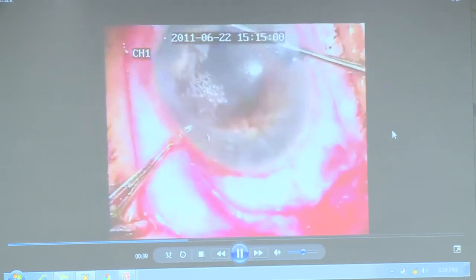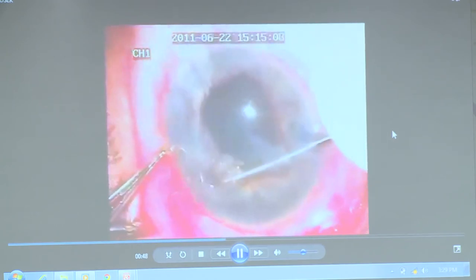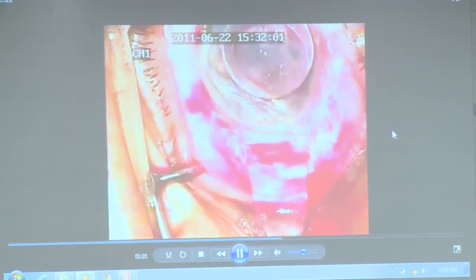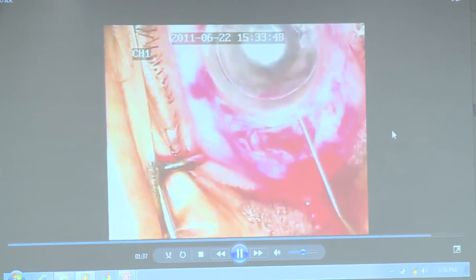Once the dissection is done, you can start the surgery. Mark the central 8 mm of area with the trephine, then dissect the diseased Descemet's membrane over the marked area and take out the Descemet's membrane. The lenticule which was dissected is capped with the endothelial side down and pushed over the Sheets glide. Then, carefully while holding the lenticule, you can take out the Sheets glide. You can wash out a little bit of viscoelastic and then inject air to get good tamponade.